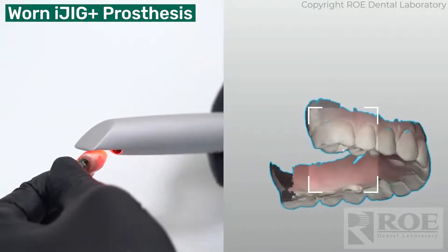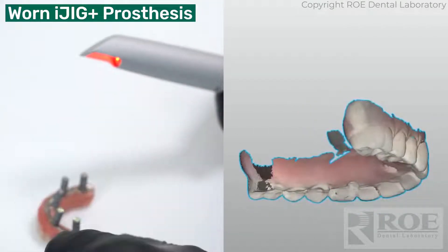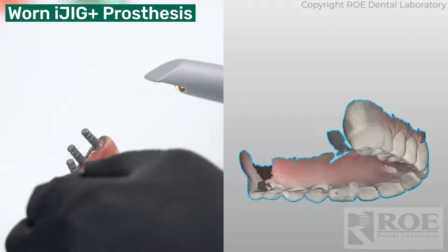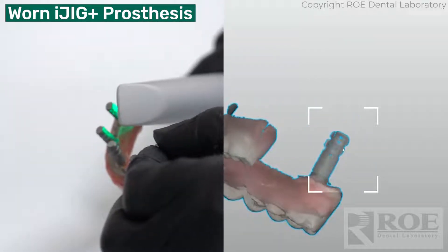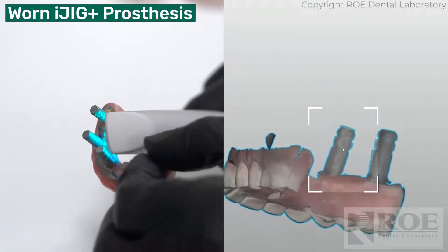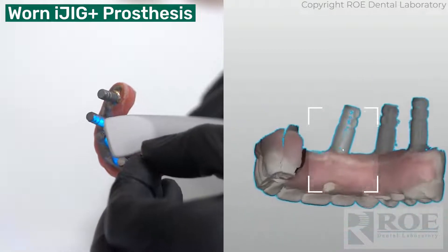So we have the prosthetic, and what you'll see next is we're going to scan the iJig scan analogs. I'm going to hold it by one of the scan analogs and then come here on the other side of the arch. I'm just going to poke up and grab one scan body like this, move a little bit down, pick up the next one, then that third one.